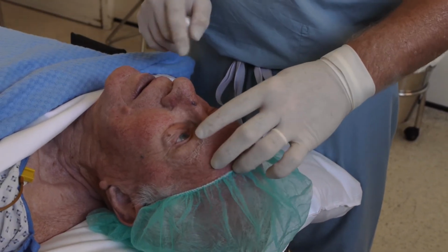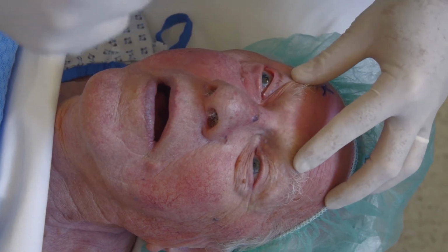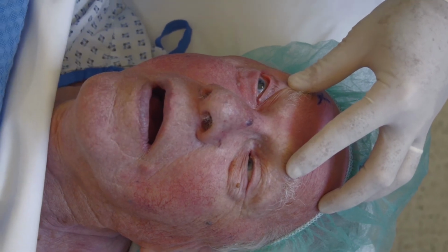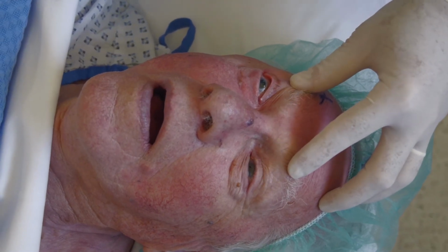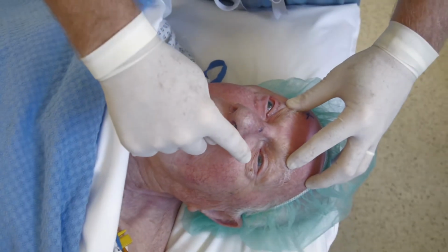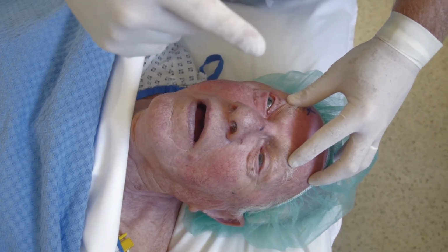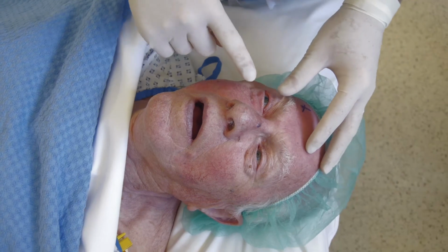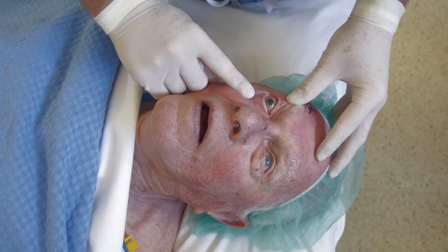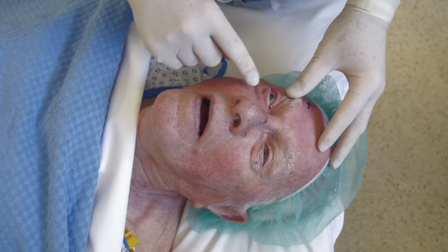You can see there's a degree of facial nerve block, and we ask the patient to follow, and you can see that there's very little movement on the right side, so there's quite good akinesia from this block. Patient cannot look inferiorly or superiorly, and you can see that the upper eyelid on the right hand side has come down, and this is very useful as there'll be very little blepharospasm during the surgery because of the facial nerve block you tend to get with peribulbars. So again, very good akinesia and very little swelling.